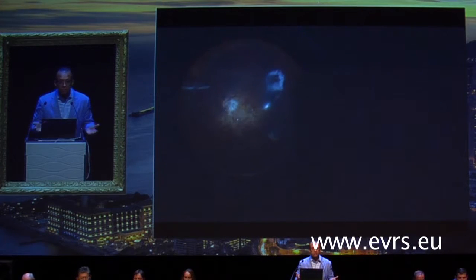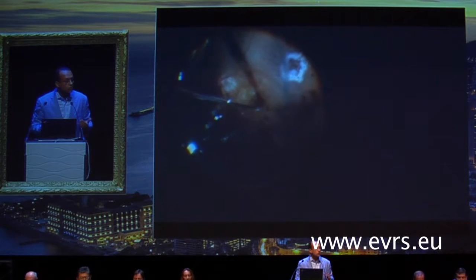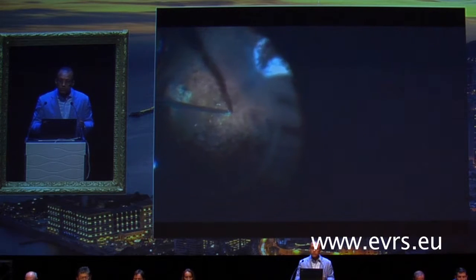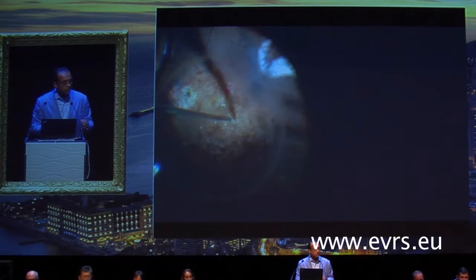So I keep adding PFC so it makes the posterior pole stable, and it can stretch over the area of the macular hole. It's also very tricky to keep it in place. So you do a high pressure PFC silicone oil exchange so it can stay in place, it doesn't fly or displace. And it's also tricky in very high myopia to remove those last bubbles of PFC because of the location of the staphyloma. Even if you try with the instruments to move the eye so that it can move to the disc, it stays over the staphyloma, and sometimes you have to remove those bubbles very carefully so that you don't remove the transplant.